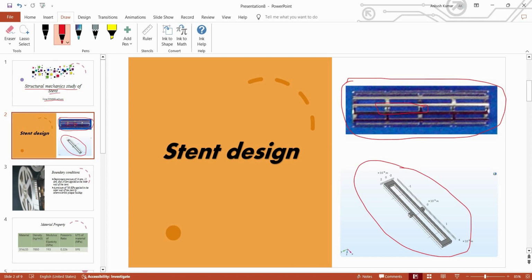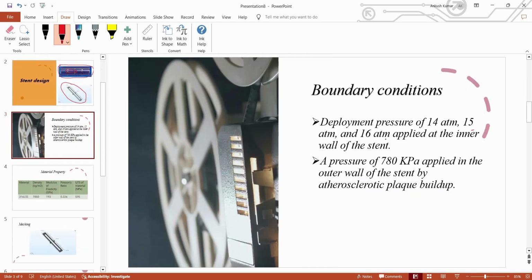For performing the structural mechanics in COMSOL software, we need boundary conditions. So what are the boundary conditions we are going to use? There are two. First one is deployment pressure. We have taken three different pressures, 14 atm, 15 atm and 16 atm, applied at the inner wall of the Stent. And secondly, we have taken 780 kilopascal pressure, which is applied on the outer wall of the Stent, which usually occurs due to plaque buildup.